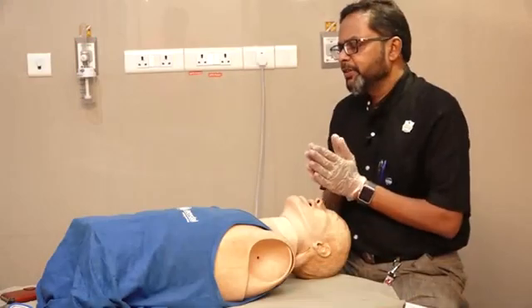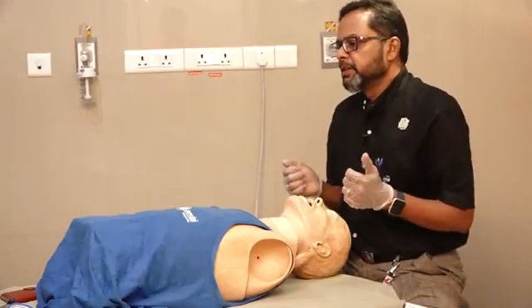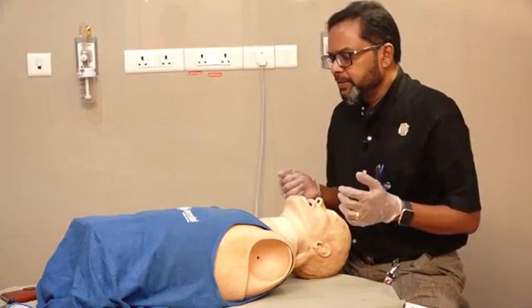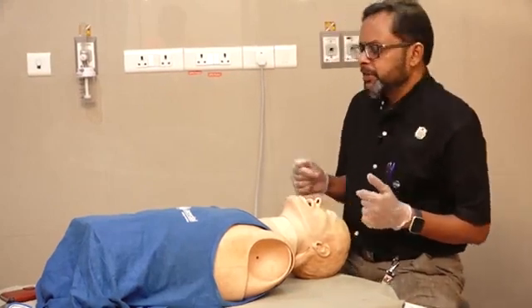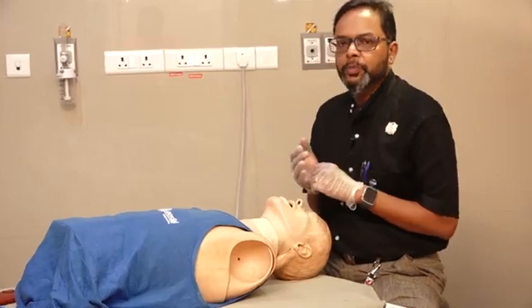Endotracheal intubation is one of the most common procedures performed in the emergency department. The most common error happening in the emergency department is wrong patient positioning.